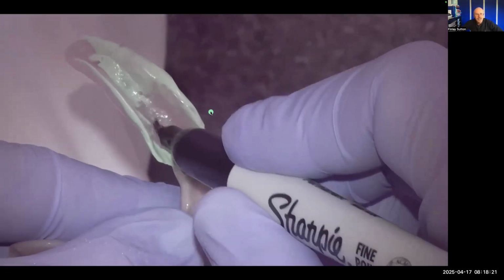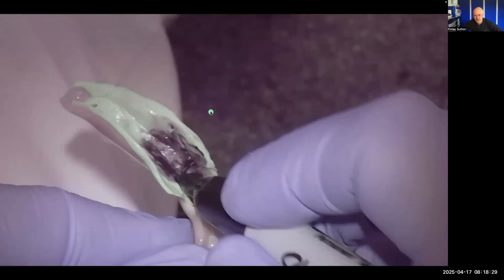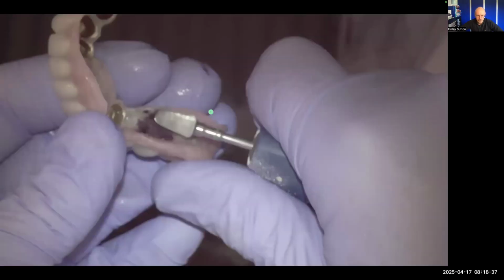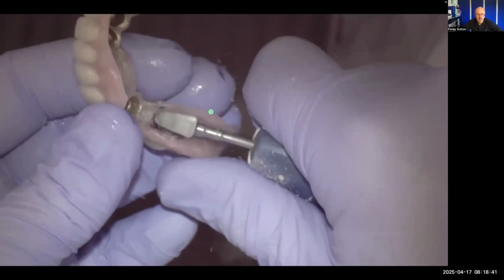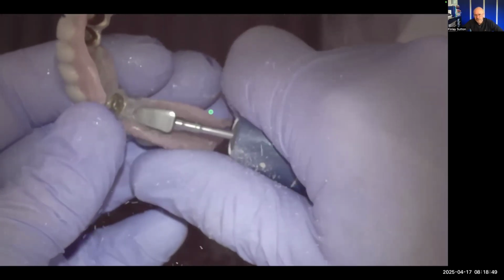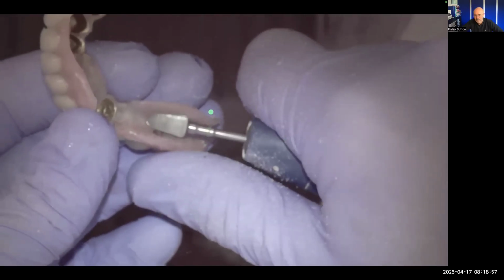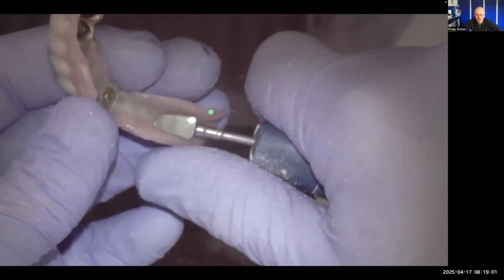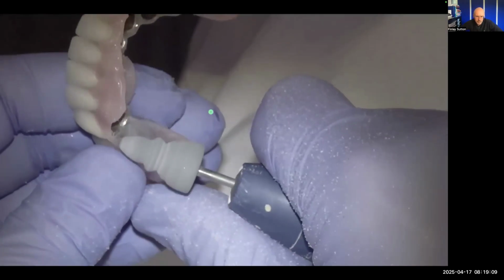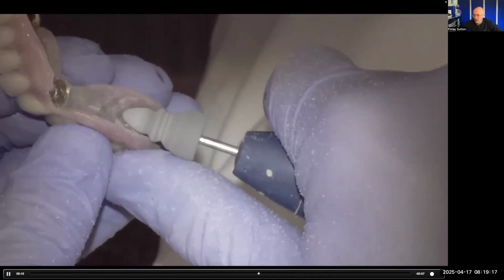So I just mark that up. I pop it into some disinfectant first, mark it up, pull it off, and now we've got a nice mark, which all I need to do is grind off. I like using a tungsten carbide, but the other thing is, if you're doing a lot of prosthetic work, I would highly recommend having a proper technician's laboratory straight handpiece, rather than using the one on the dental unit. They work much better. Then just polish that up with the polishing rubber and finish that there. I just repeat that process until it's totally comfortable.